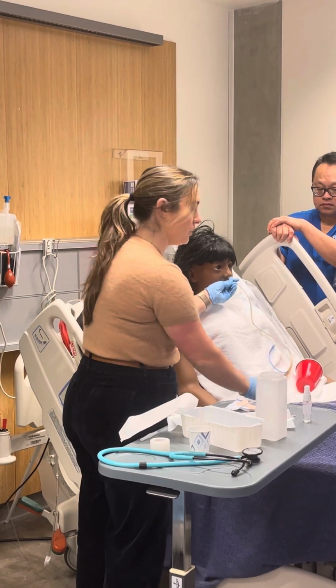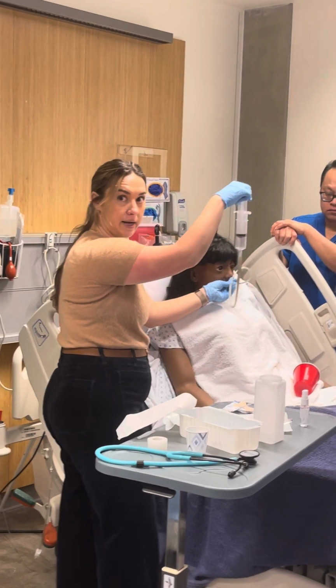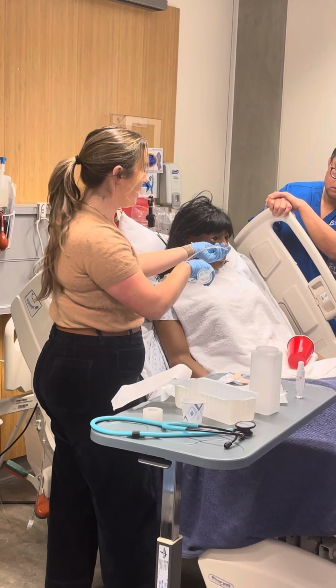The other way to do this is to aspirate some GI contents. So you pull back until you get a little bit of bile in here, and then you're gonna disconnect. Notice how my hand is really stable up next to her face. I kind of have my hand on the cheek.